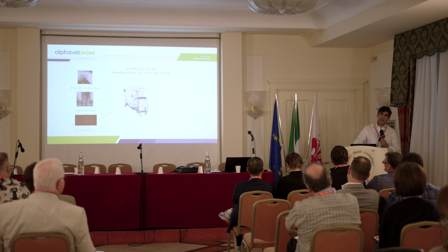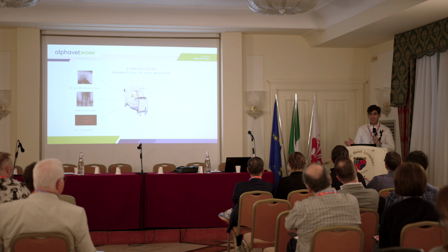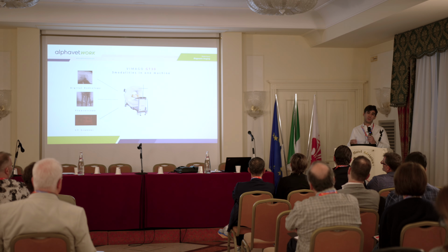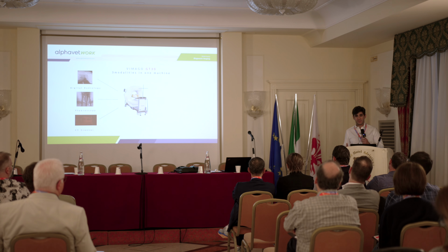I was a radiologist in a big brand, and we had a lot of cases from all over the world, from Japan, the States mostly, the UK, Europe. And when you have a CBCT, the same company said, we don't accept clients from CBCT because we don't have a standard quality of images, so we cannot report. Sometimes we had a CBCT of the head, and I couldn't distinguish the muscles from the lymph nodes. So it was dangerous for us to send a report. And that's the main cause of the rumor that CBCT is not good enough.